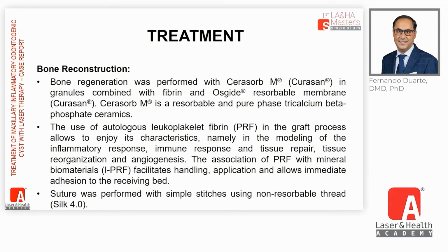The use of autologous leukocyte-platelet-rich fibrin in the graft procedures allows us to enjoy its characteristics, namely the modulation of the inflammatory response, immune response and tissue repair, tissue reorganization and angiogenesis. The association of PRF with mineral biomaterials, the i-PRF, facilitates handling, application and allows immediate adhesion to the receiving bed. The suture was also performed using non-resorbable threads.